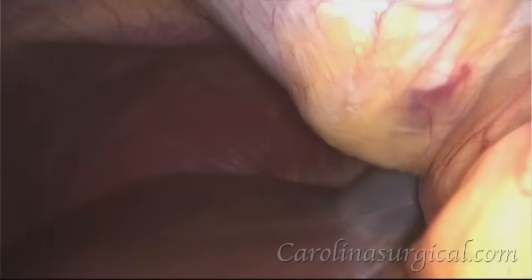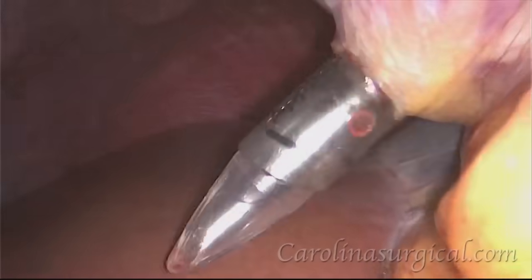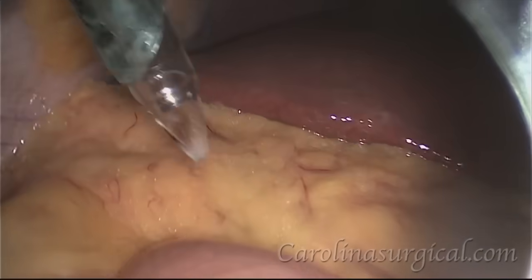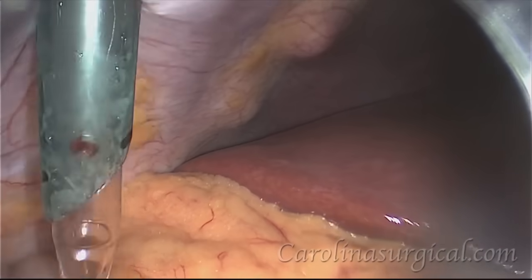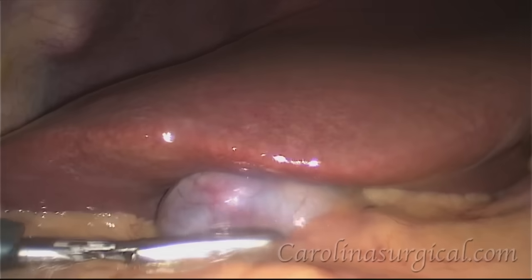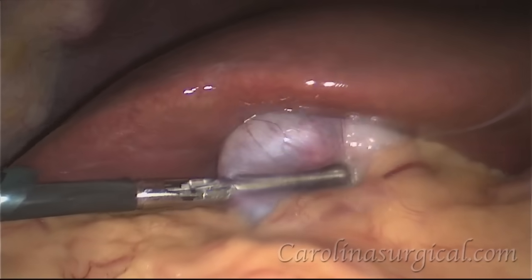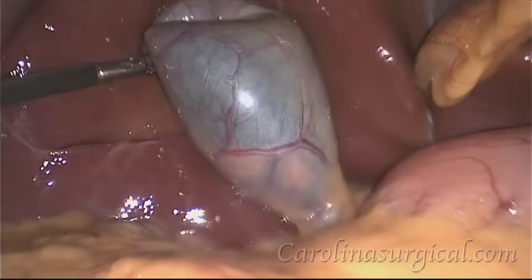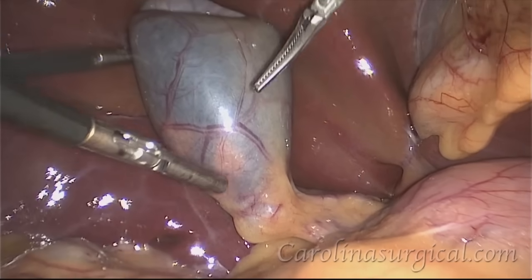We insert another trocar through the abdominal wall, a third, and our fourth and final trocar. These trocars allow us access into the abdomen so that we can place our instruments in and out of the abdomen to do the surgery.